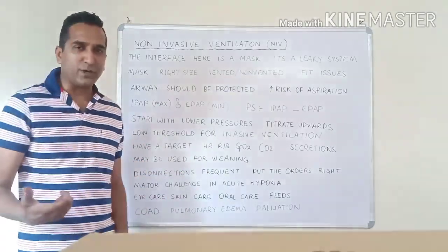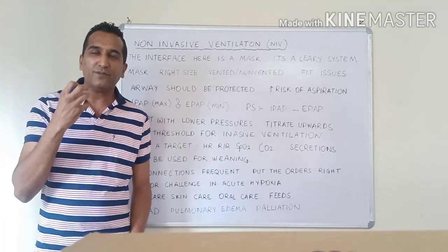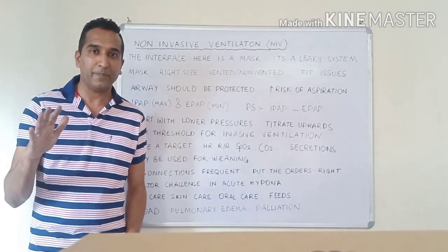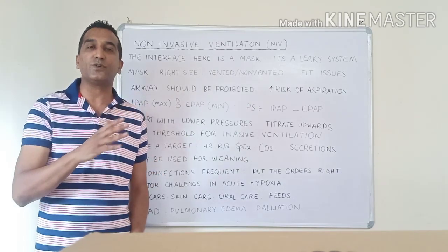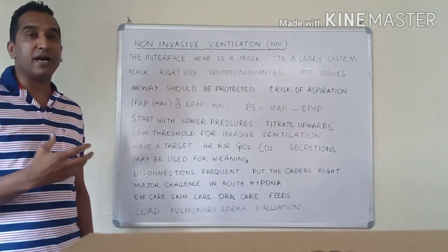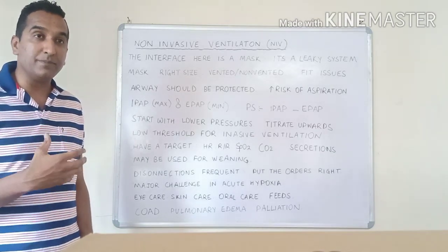Disconnections with NIV are frequent. The patients are awake, they can respond to you. You can hear the voice even from inside the NIV. They may ask for water, they are thirsty, they are hungry. You are not sedating them. It is not a patient who is on an invasive ventilator, you have put them in a RASS score of -3 to -5, you are taking care of the feeds. It doesn't happen like that. Many of them are taking orally, many of them may ask for water, many of them may want to talk when the attendants and relatives come.